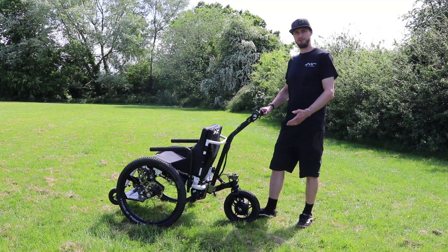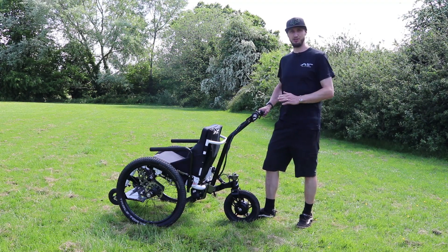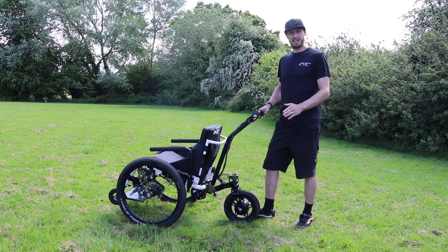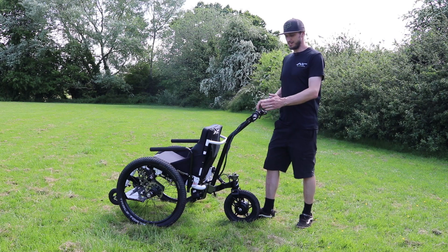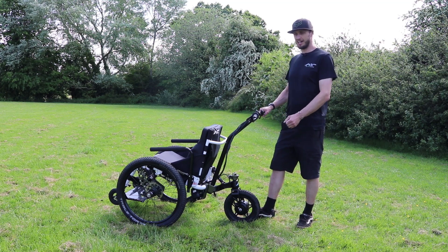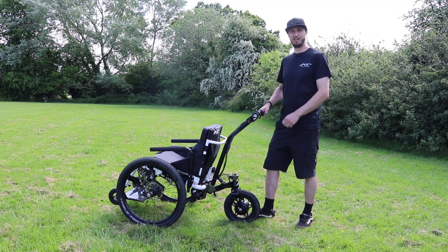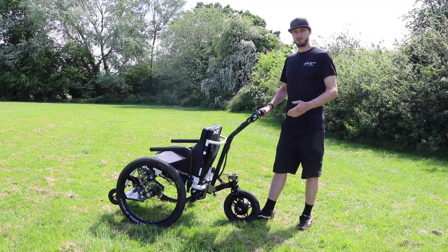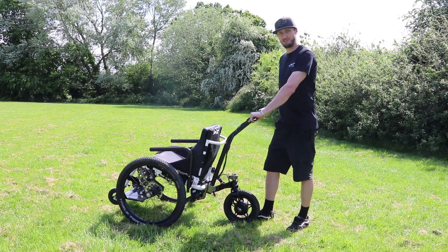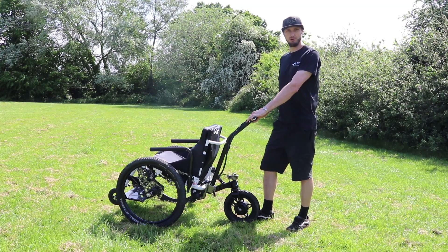It's important to remember that the E-Push is electric assist — it's only really intended that the motor power is used in difficult situations like very steep hill climbs, or if the person pushing is pushing someone quite a bit heavier than themselves. On very flat ground you really won't need to use the throttle, so just push and direct it manually. On very tight turns it's also advisable not to use the motor — it's best to maneuver manually because the motor could very quickly spin the trike around faster than you want it to. The attendant takes full responsibility for control of the E-Push, so hold nice and firmly onto the handle. When going downhill, you can use the brakes to control your speed — drag them gently and that prevents the trike going too quickly down a slope.